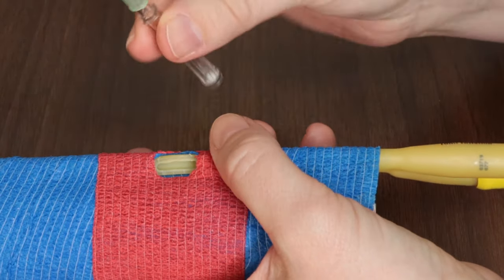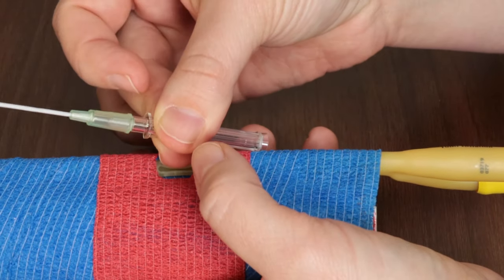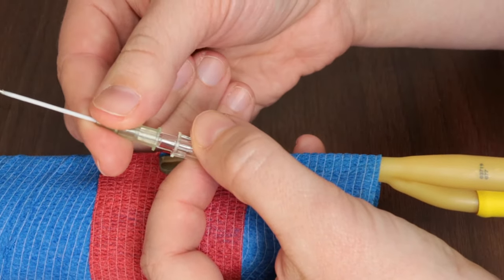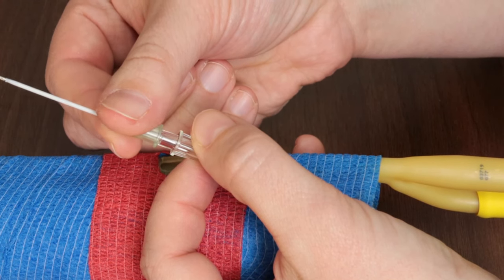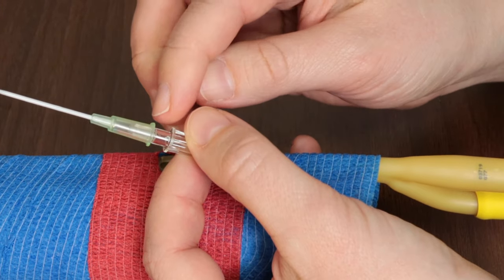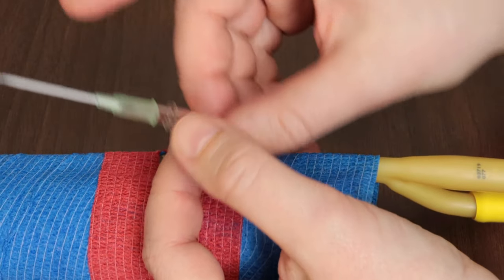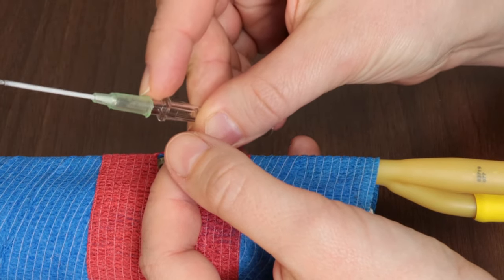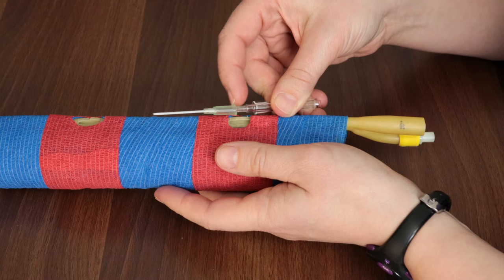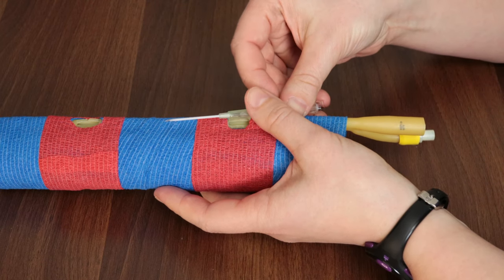And what I really like to do with these guys is use my thumb and my second finger to control and drive the stylet. And then if you look closely, you can see that there are a couple of little notches right on the actual catheter. This is for the locking, to be able to lock the cap on. So I like to lock my forefinger nail on this. So it's all separate drivers. This controls my stylet, and this guy controls my catheter, pushing him in or having this tab locked under my nail to pull him back to the stylet so I don't run into that issue.